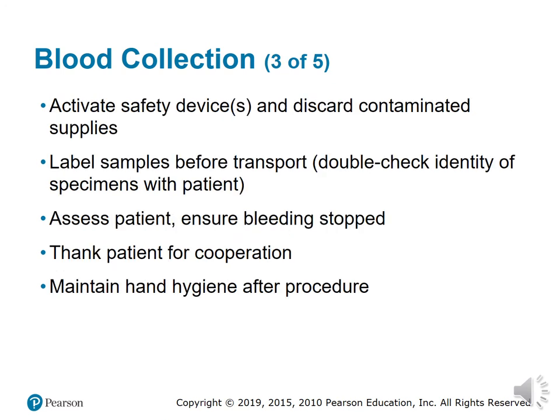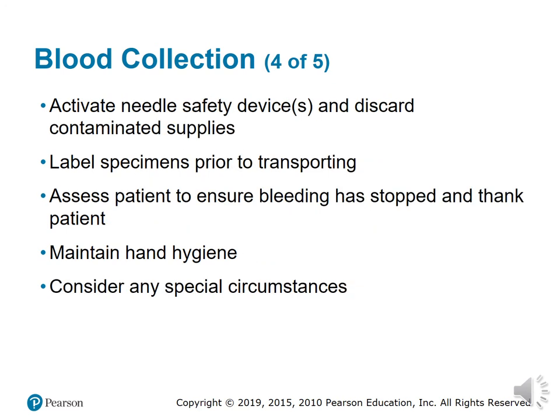Activate safety device and discard contaminated supplies. Label samples before transport. Double check identity of the specimen with patient. Assess the patient, ensure bleeding has stopped. Thank patient for cooperation. Maintain hand hygiene after procedure. Activate needle safety device and discard contaminated supplies. Label specimens prior to transporting. Assess patient to ensure bleeding has stopped and thank the patient. Maintain hand hygiene. Consider any special circumstances.